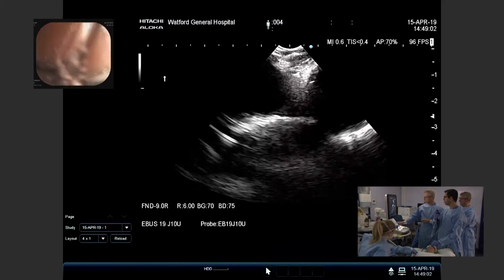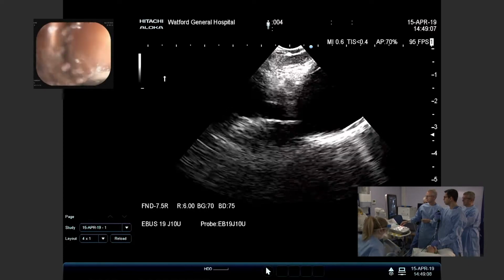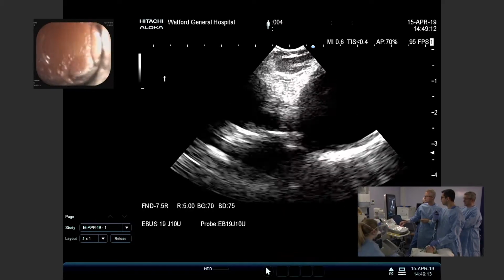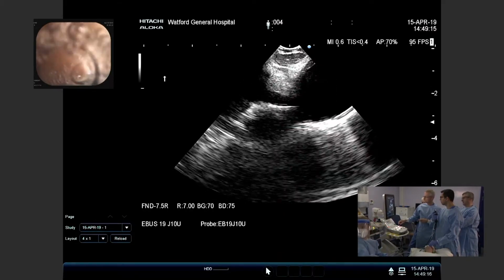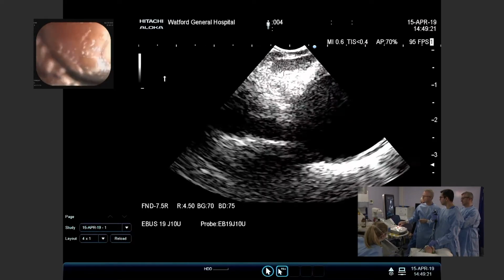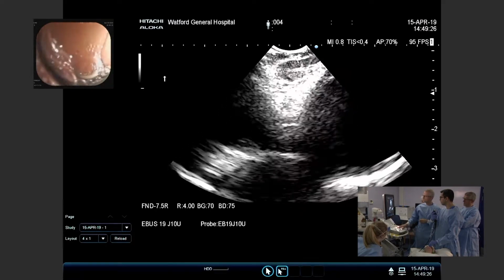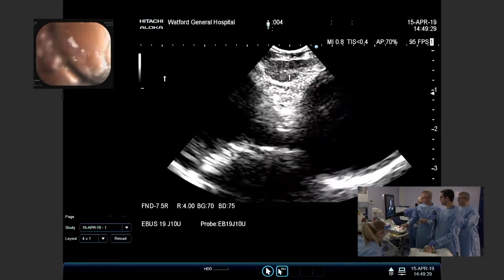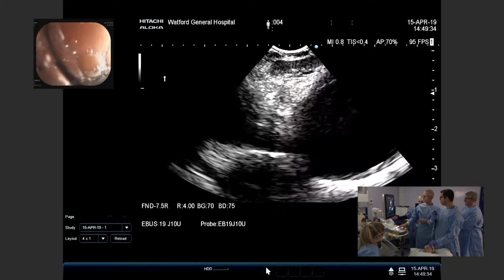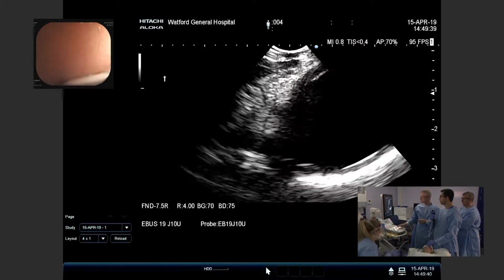That's now the aortopulmonary window, and again there's a small lymph node at the top there. I think it's got a central hilum in it, a fatty hilum. Where your arrow is, there seems to be hilum. And you can see the rhomboid shape, about 4 to 5 millimeters in size, so it has got all benign features.